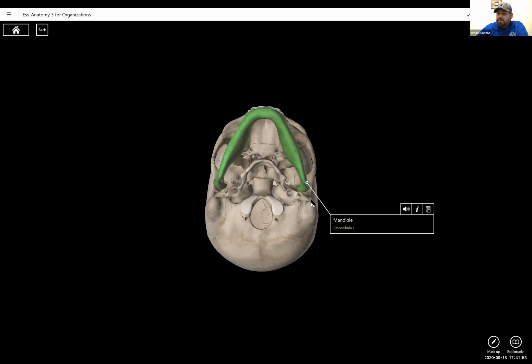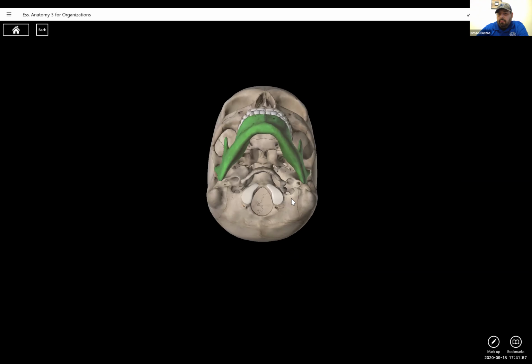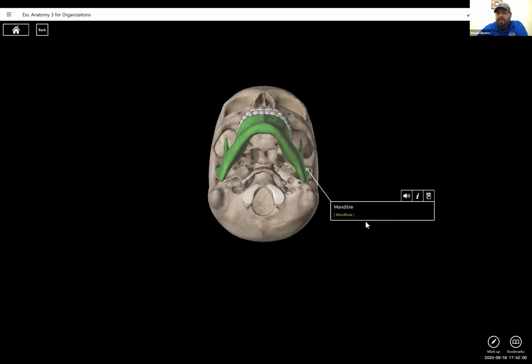But what else can cause that? Because what if I'm like this? How is my CR supposed to be in comparison to that? If I show you this, my patient's like this, he can't fully extend. How should my CR be? It shouldn't be perpendicular to the IR, because then this is going to cause the mandibular rami to get superimposed over the mastoids.